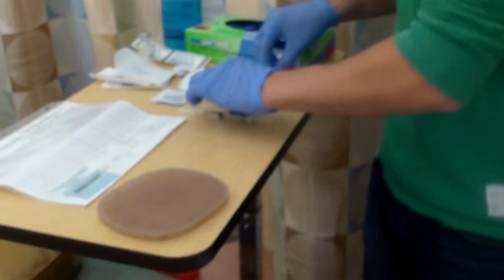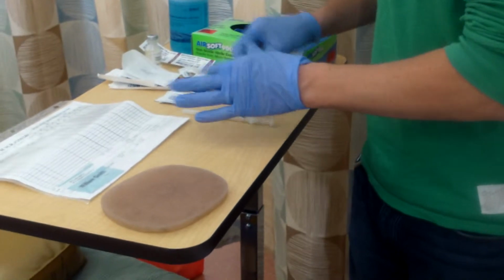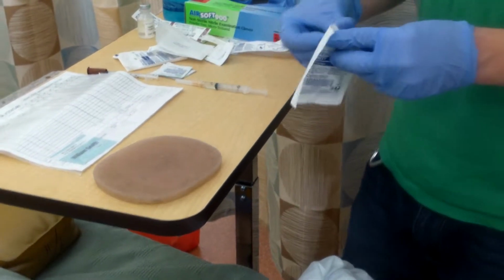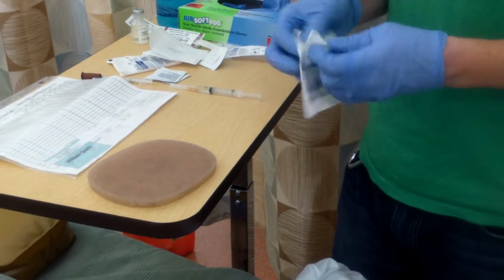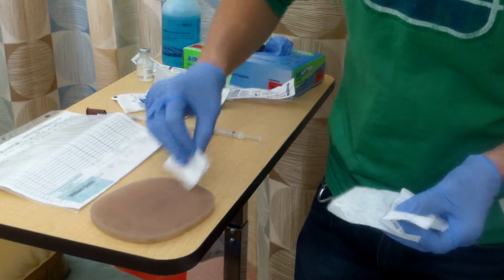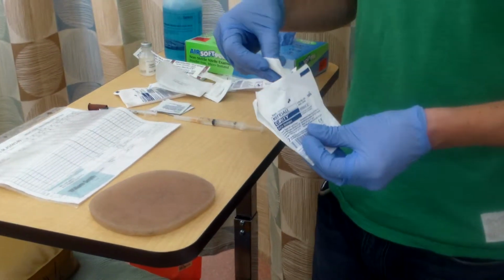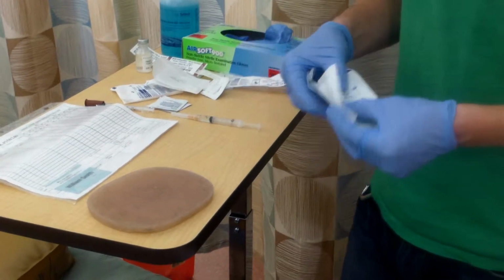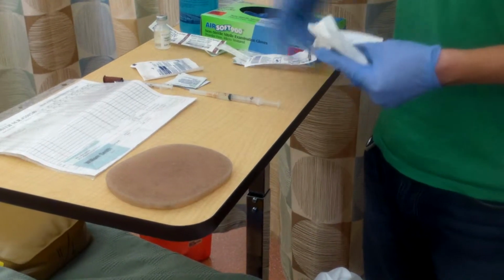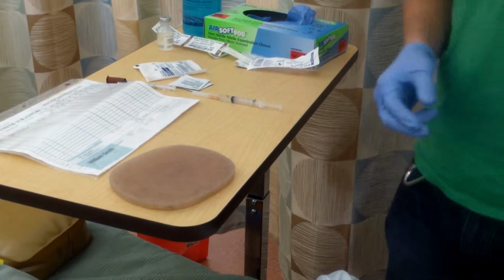I need to save this for later. So do that. And then I would use a piece of gauze just to wipe up any excess medication that comes through. So just gently wipe that up, just not really touching it because there should be a wheel formed from that. So I'm going to discard this along with all this other stuff. Put that in the trash.